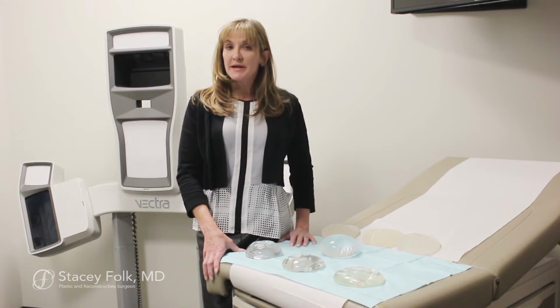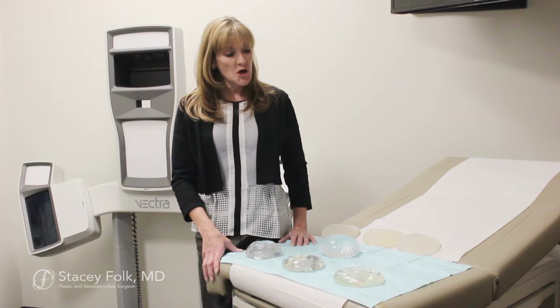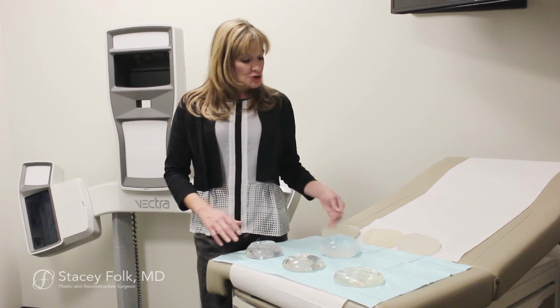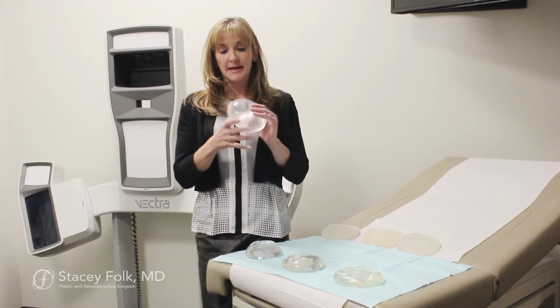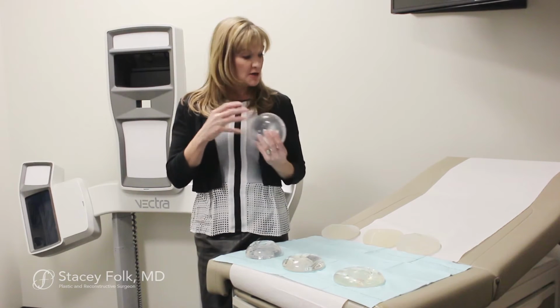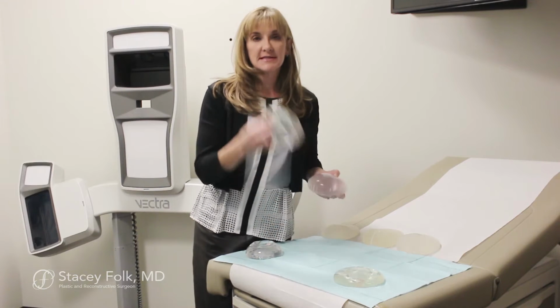Today we have so many different implant types available, it can seem very overwhelming. So let me just cover a few of the basic things about breast implants. Initially, you may think about having a saline implant, which is filled with salt water and has a smooth, or we can also have potentially a textured shell, or you can go with a silicone implant.